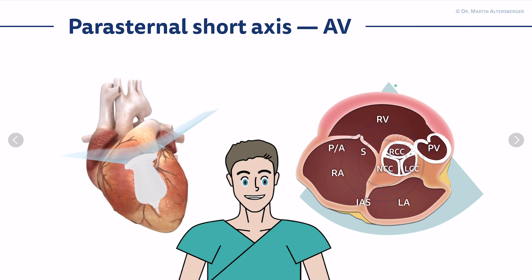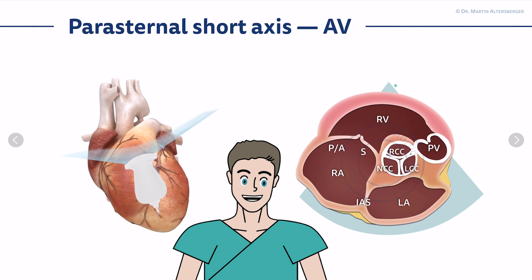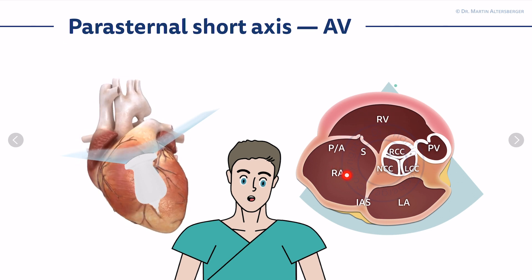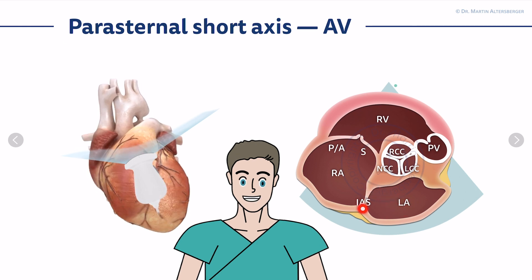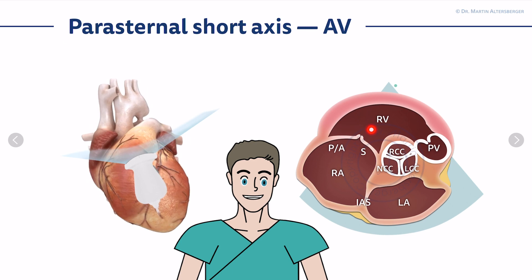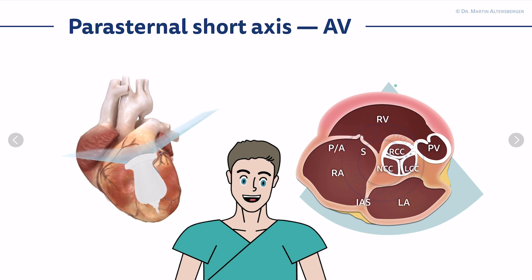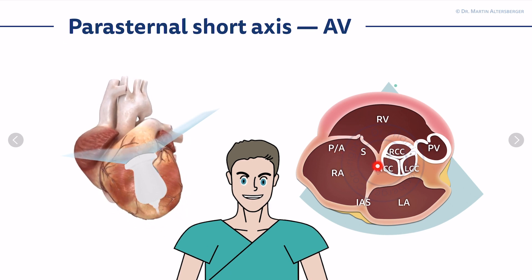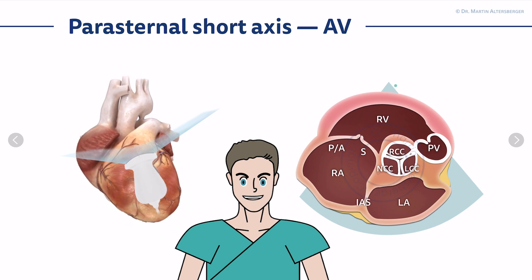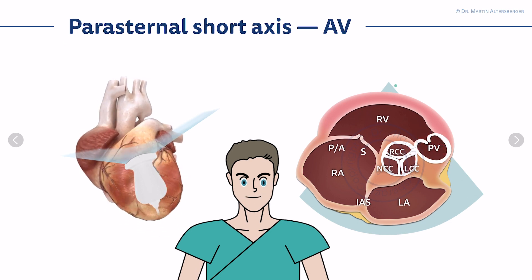There are more structures you can differentiate: the right ventricle, the right atrium, the left atrium, and the interatrial septum in between. The tricuspid valve is a very important structure in the parasternal short axis views, as is the pulmonic valve and even parts of the pulmonic trunk.